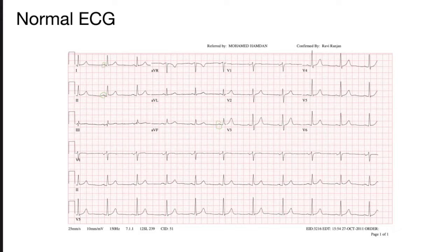Sometimes they can be obstructed by noise. Derek, can you circle some QRSs? Another one? Do one more. And then Tanner, will you circle some T waves? Okay. Cool. So this is how we're going to go through a bunch of additional ones. We're going to look at the rate, and then we're going to look at the rhythm. And then we're going to try and figure out what disease might cause a specific rate or a specific rhythm.